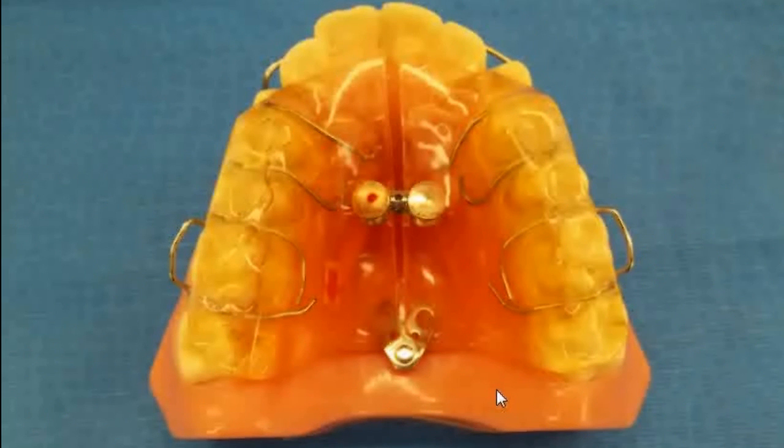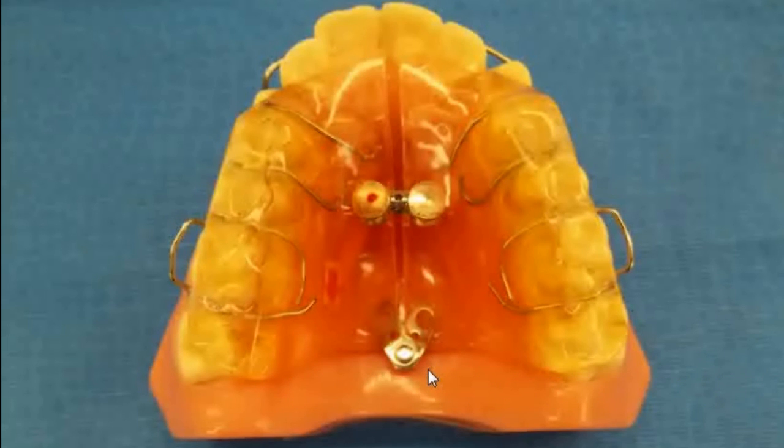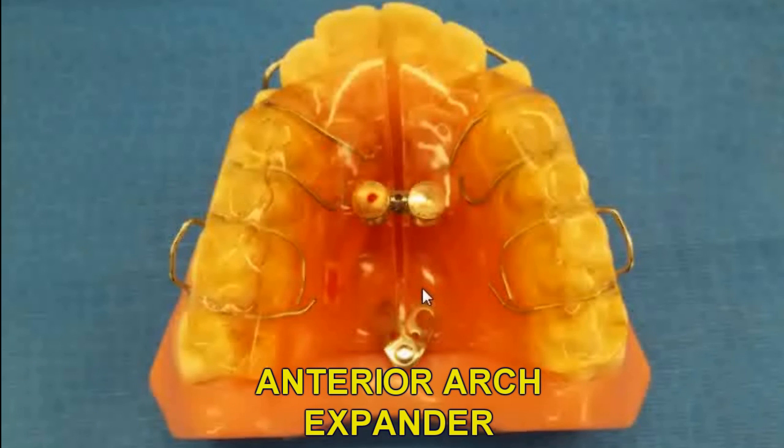In some cases, you'll find the patient has a V-shaped or Gothic arch, and you only want to expand in the anterior region. You can do this by using a fan expansion appliance. This appliance has a special screw in the anterior region and a hinge in the posterior. As the screw is turned, the hinge prevents the posterior from expanding, so only the anterior section is affected.